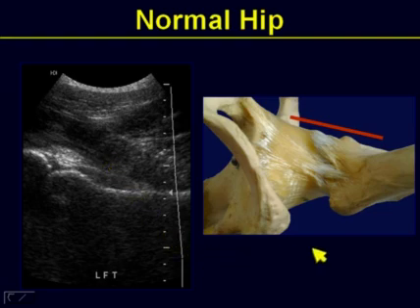So while everybody is familiar with color images of gross anatomy, we're now going to proceed in talking about the grayscale imaging. Note too that when we look at the adult hip, more often than not, we're using the curvy linear array transducer for the depth that's involved in looking at this hip joint.